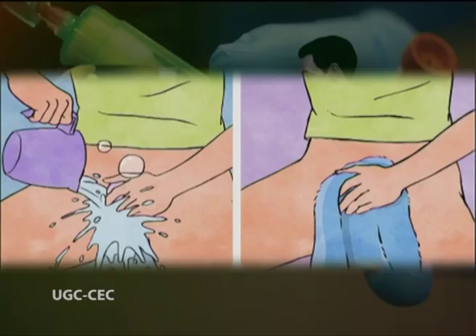misleading results. All methods used to collect urine samples can result in contamination with bacteria from outside the bladder. This can lead to an inaccurate diagnosis, involve unnecessary treatment, or require a sample to be repeated, which has implications for the patient's care and cost effectiveness.